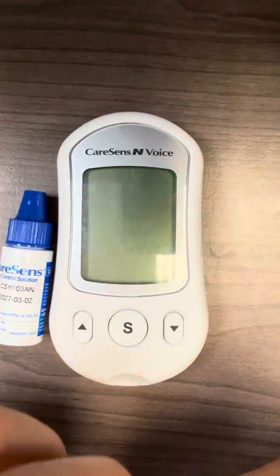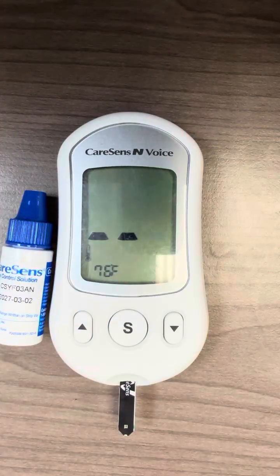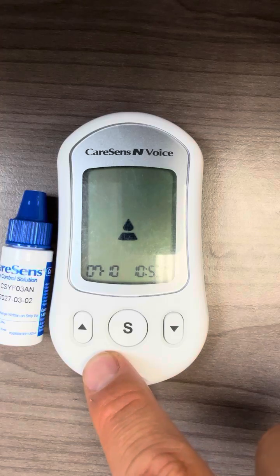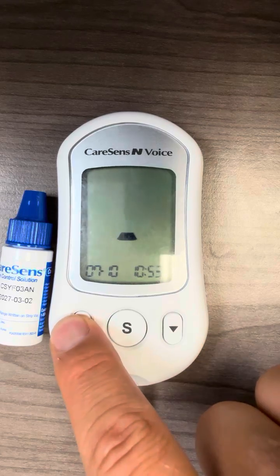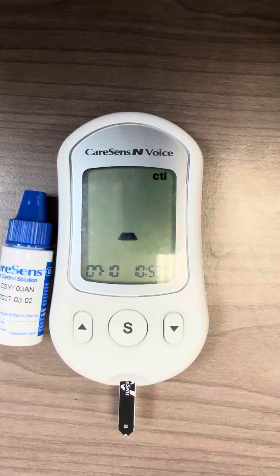So first of all, take out a test strip and insert the test strip into the meter like so. The meter will display a blood glucose test prompt. From there, you're going to press and hold the up arrow button for three seconds to mark it as control solution testing.